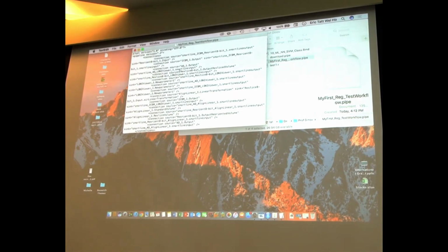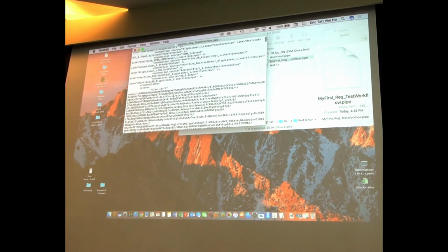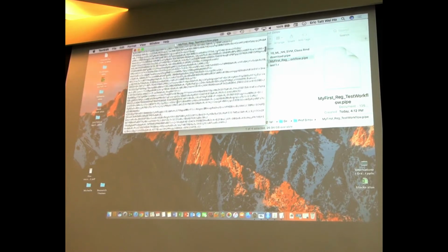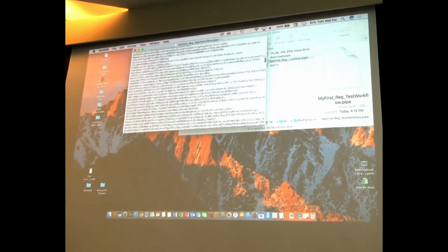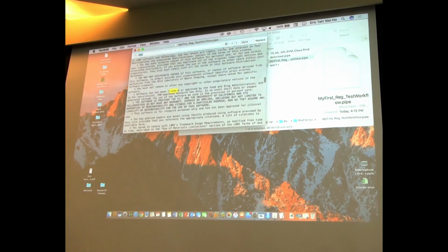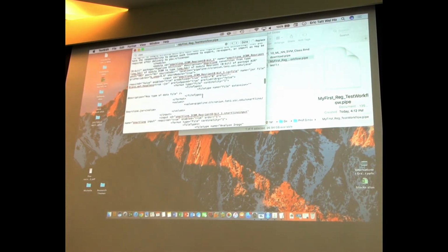So that's what these module definitions look like. For example, here is where it defines these connections, the executables. Here are the icons that get stored. The icons are really big because they're binary images represented as text. See, there are descriptions. Here is the module ID name, inputs that are defined in them, how much memory they require, all kinds of metadata.